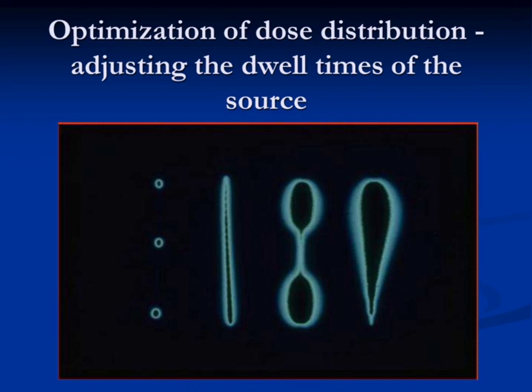Each applicator is fixed in the patient and a check X-ray is carried out with a localized dummy source in the applicator. You see here the cesium machine, and you can see the flexible catheter moving from the machine to where the patient is, in the other room.